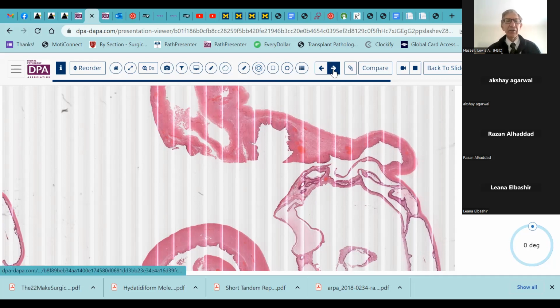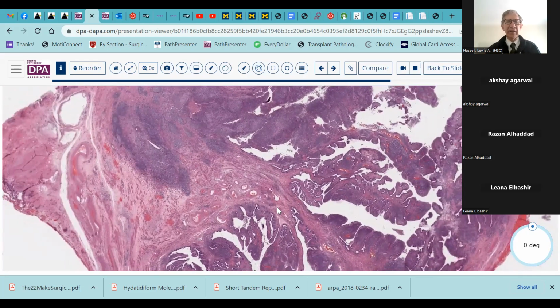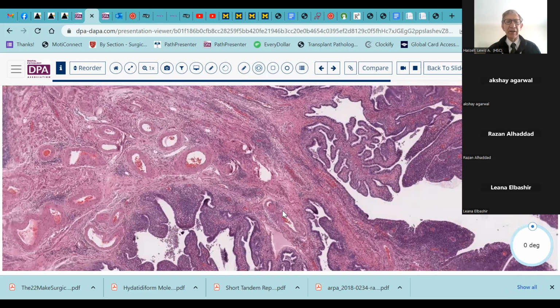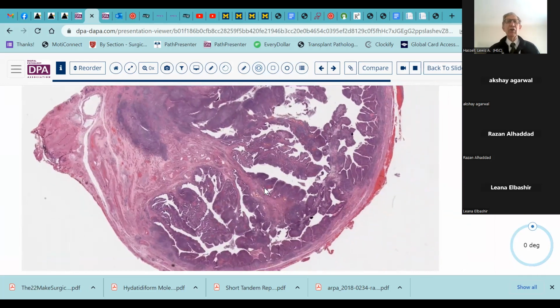So let's go on to some more cases and talk about the next case, more recognizable as a fallopian tube. It's clearly a tubal structure. And probably you've got the sense that it's a little bit dilated. Now, obviously, depending on where we section the tube, we can get a very small, 1 or 2 millimeter in diameter lesion or structure, or a several millimeters in diameter structure, as in this case, as we get more peripheral towards the ovary and so forth. When you section the fallopian tube in the isthmus, you're going to get a very narrow, small pinpoint lumen, as well as more close to the uterus. Whereas as you become more peripheral, that's where you get a little bit more dilated, more fimbriated, expansile type of lesion.